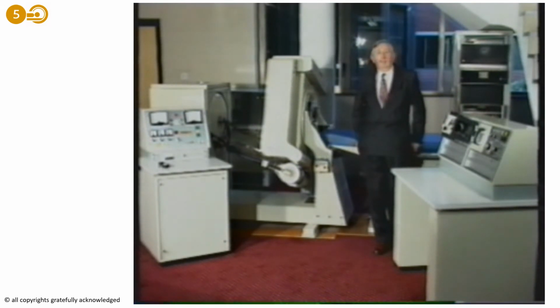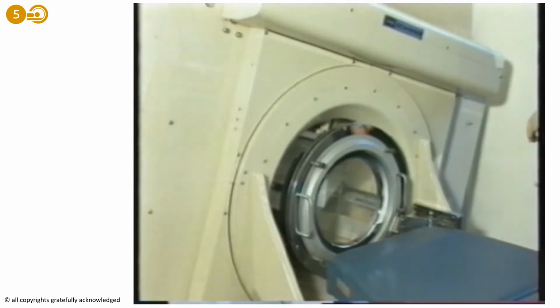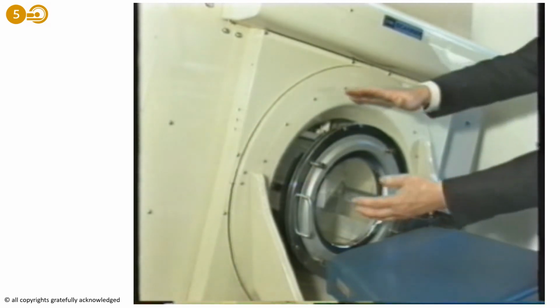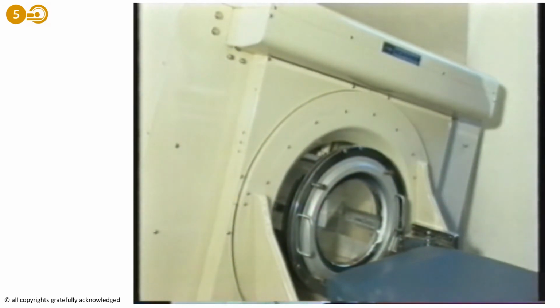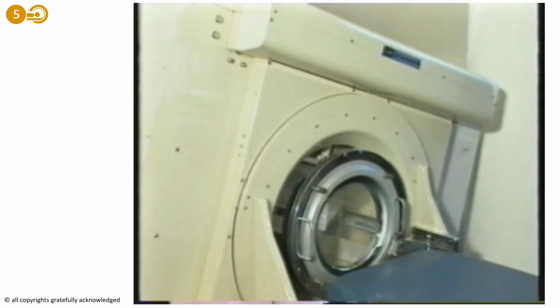Well, eventually a clinical machine was built, and this is one of the first production models, similar to the one used at Atkinson Morley Hospital, Wimbledon, which was the first head scanner to be tested. In a similar way, the X-ray tube and two detectors scan backwards and forwards across the head, the whole assembly rotating 180 degrees around the patient.